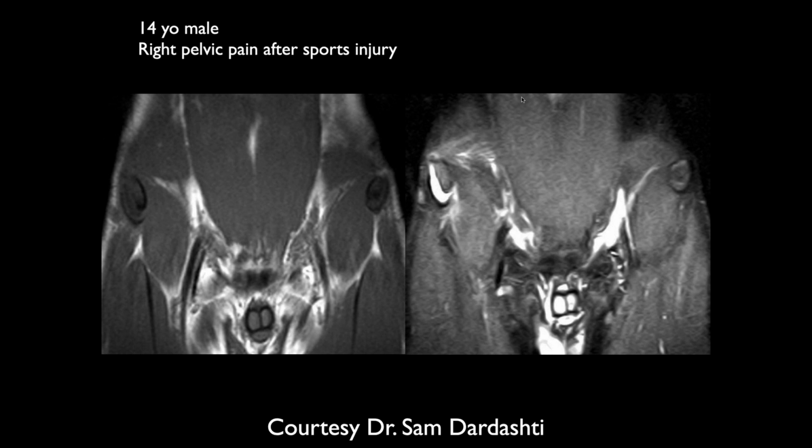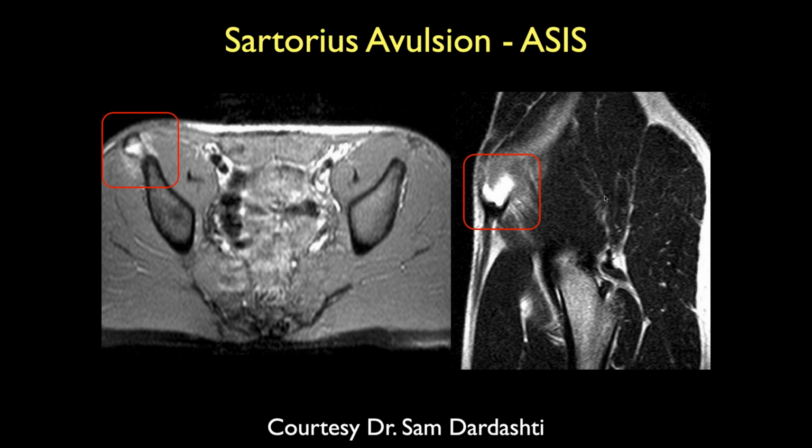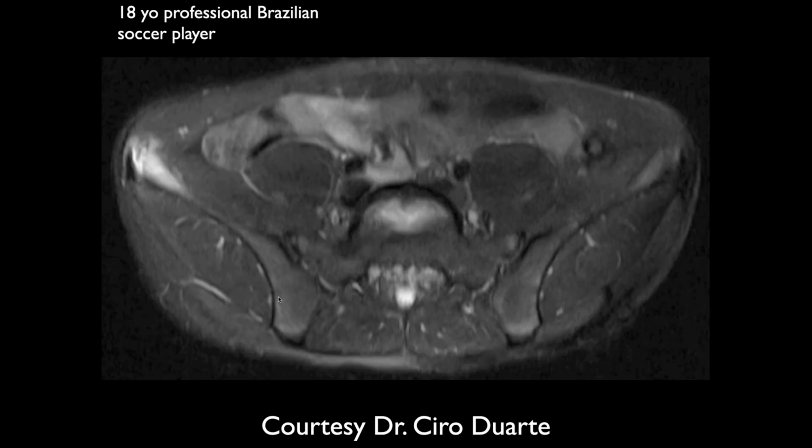On the right side, a 14-year-old male with right pelvic pain after a sports injury. There's focal edema at the anterior superior iliac spine on the right side. I'm kind of worried about an IT band or Sartorius injury. I don't think I see bony fragments, so it looks like just a tear. It doesn't look too retracted. High-grade partial tear probably. Okay, there's an avulsion fragment. I think this turned out to be a little bony fragment.